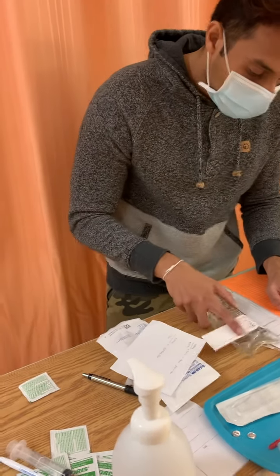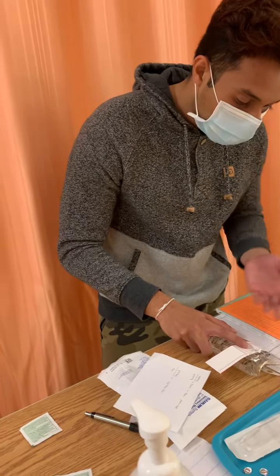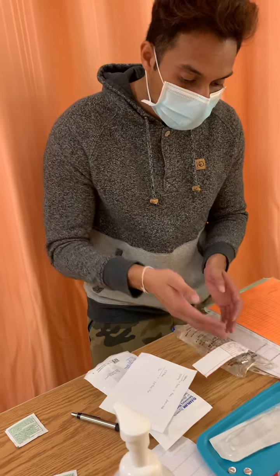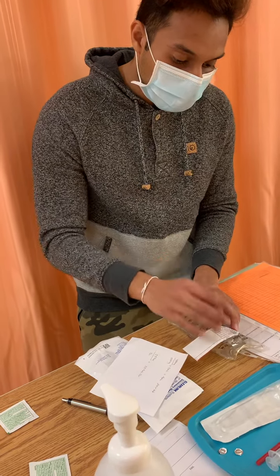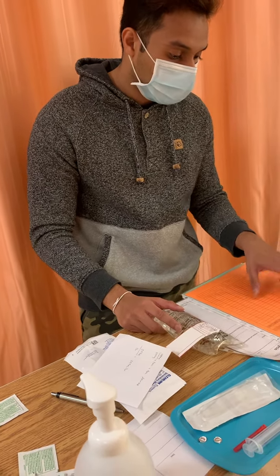So we have here Watson, William. Medication is Azithromycin, 400 milligrams. It's a dose of 400 milligrams, 4 mLs in there. And we injected 4 mLs in there, and there's 254 mLs total in the mini bag, so that's good. And it's given daily, so it's not been given today. We're going to give the medication now.